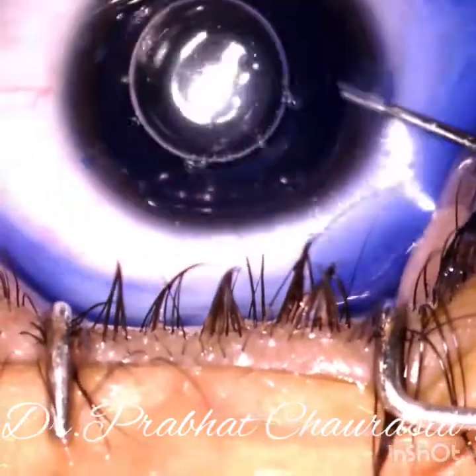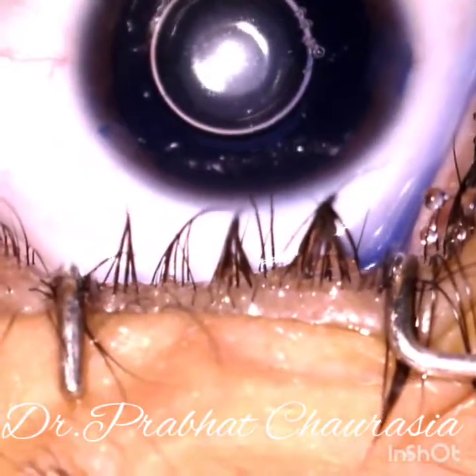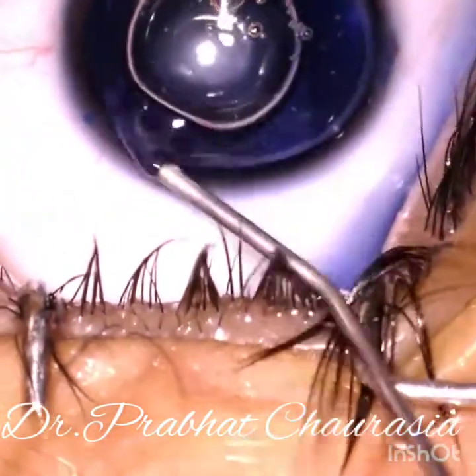Wash the dye thoroughly and then inject HPMC 2 percent in the anterior chamber.